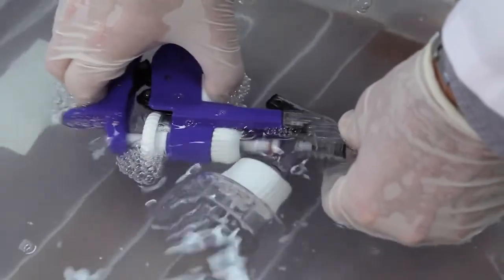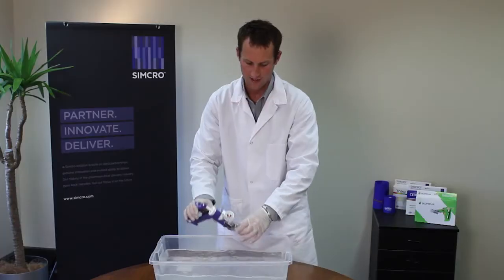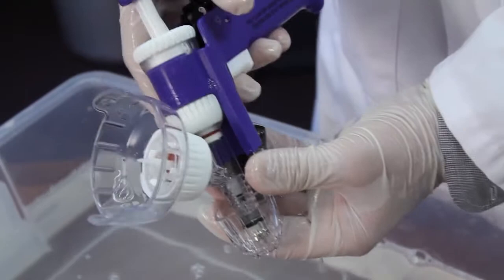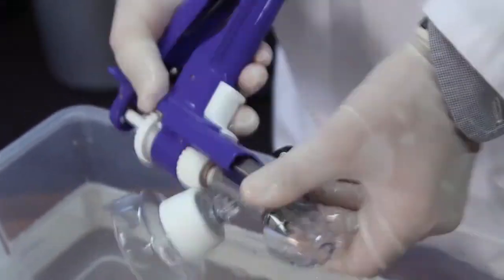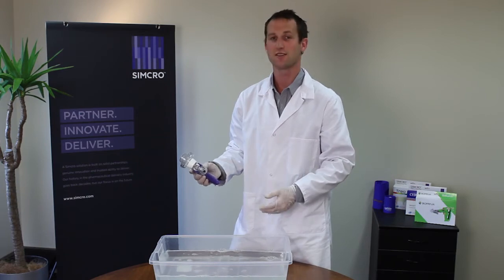That runs warm soapy water through the system and cleans everything out. Then obviously the final step is just to get everything out of there, leave it to dry, and it's ready to use next time.